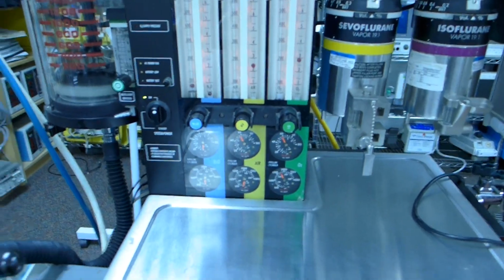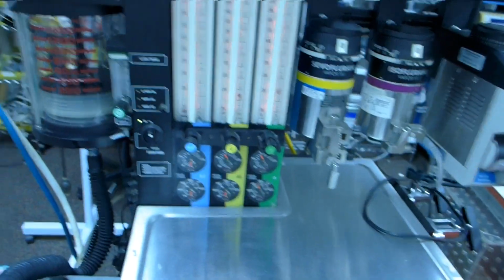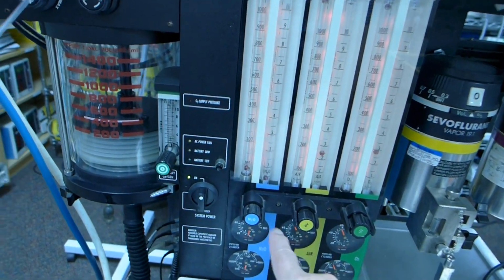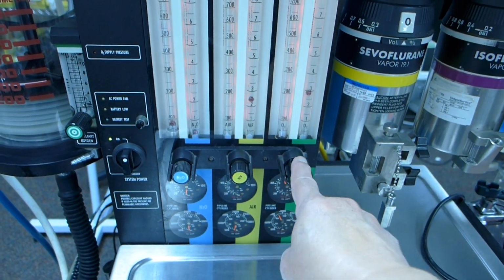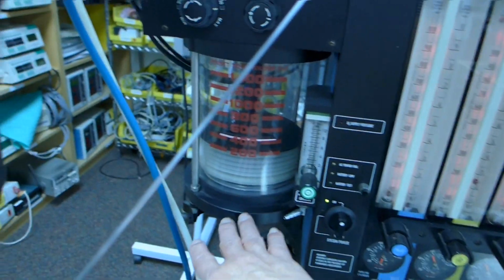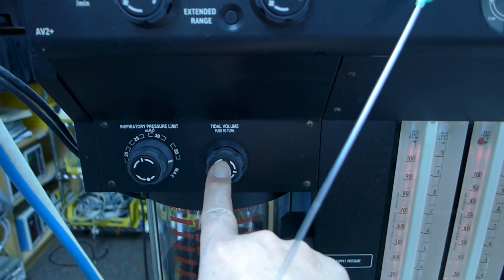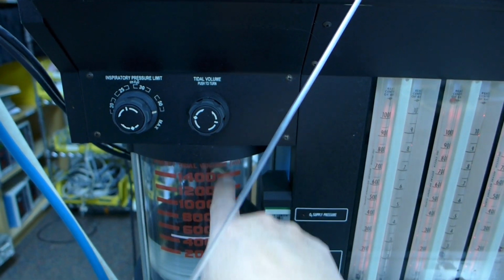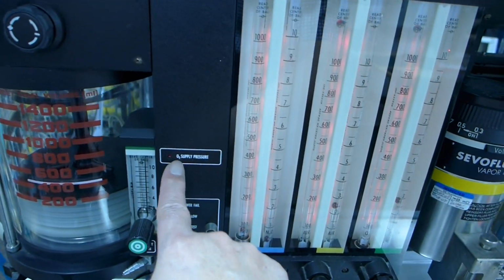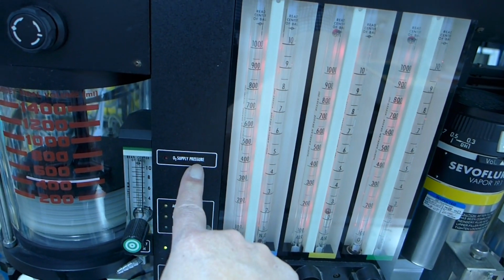And then we can turn on this anesthesia machine here. So as far as the machines, we can set this machine right now. It is a three gas machine: again, nitrous oxide, air, and oxygen. On the left here, it's got the bellows, inspiratory pressure limit, tidal volumes. So you can set tidal volumes or flow meters to connect the nasal cannula. Oxygen supply: if we lose that oxygen supply, it's going to alarm because oxygen is a life support gas.